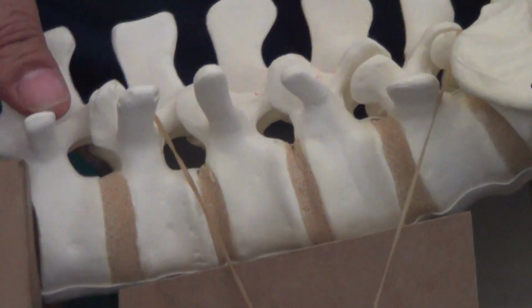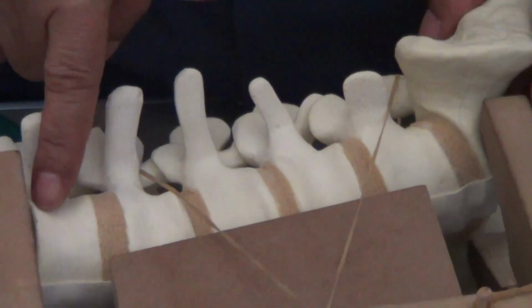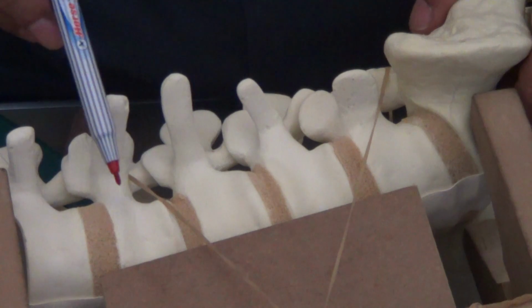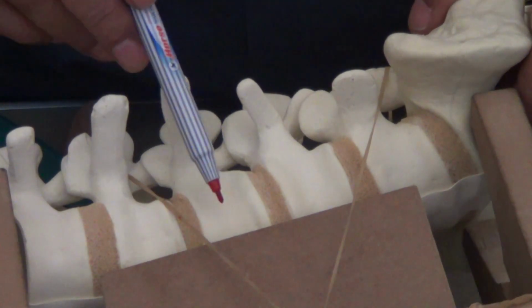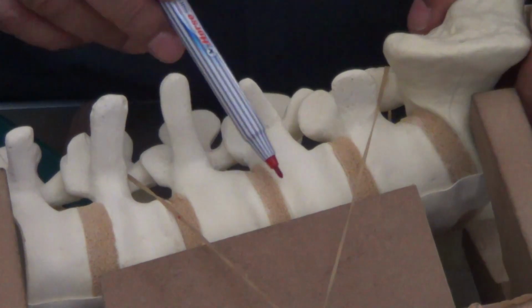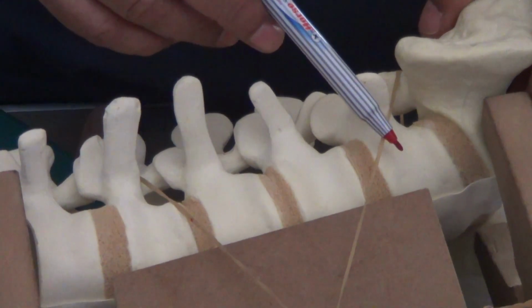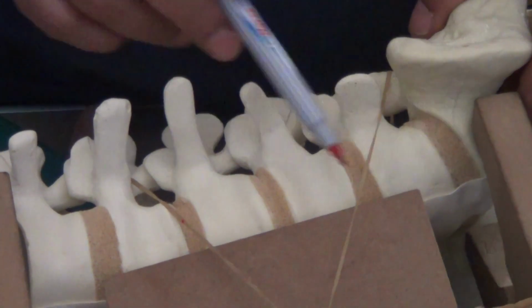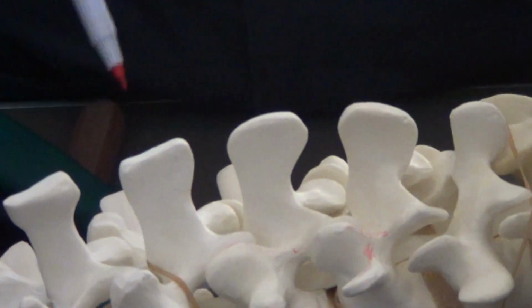The other thing to notice is, as the one was trying to say, the lumbar spine has got a curve here. So if you look at the direction of the pedicles, it is almost straight at L2 and L3, and then the pedicles start turning downwards, 15 degrees, 20 degrees, 30 degrees. So L5 will be about 25 degrees down caudal, and L3 would be vertical. So when you enter, you go there.